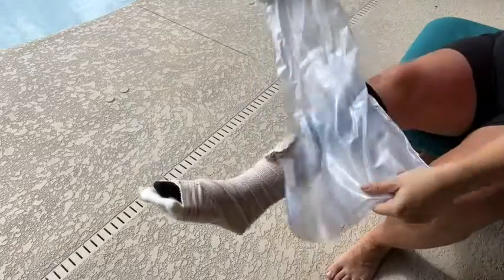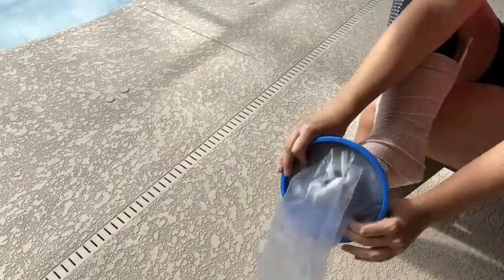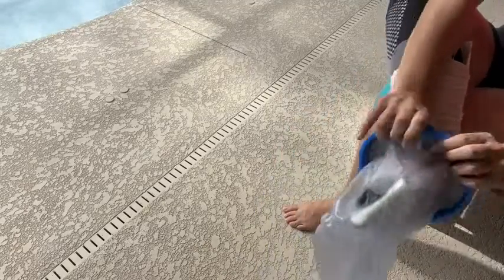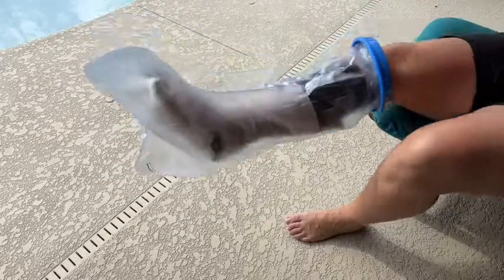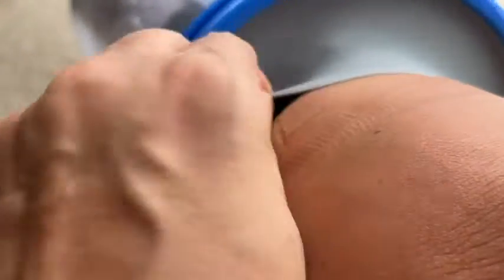This is a reusable waterproof cast bag from TKWC Incorporated. It has a very large space for your leg and foot, so anything below the knee, ankle, or foot area will be protected. It is latex free — and that includes this rubber opening where you put your foot — which holds very tightly against your leg so you don't have to worry about any water leaking in.